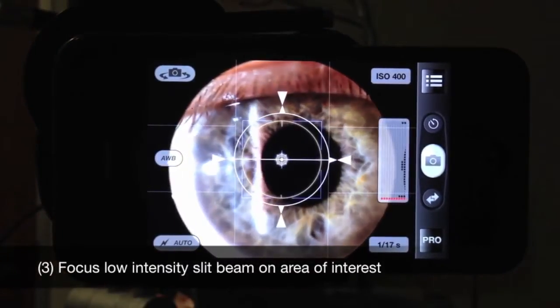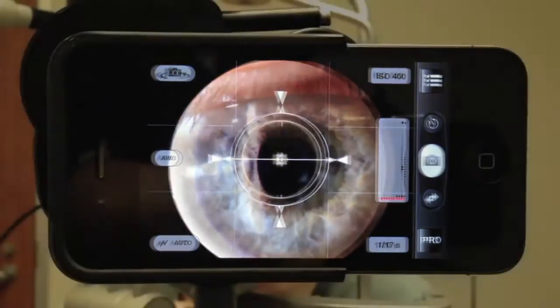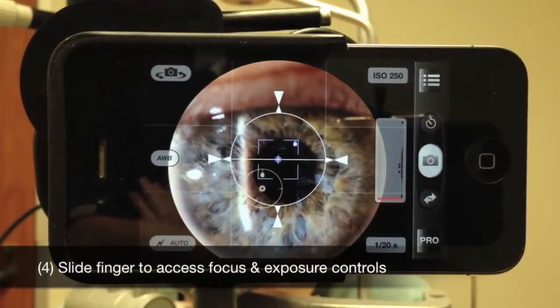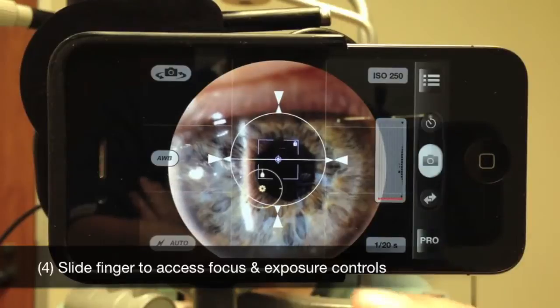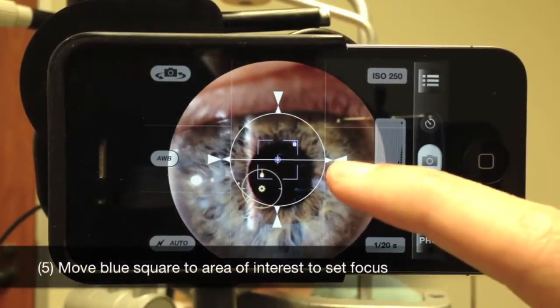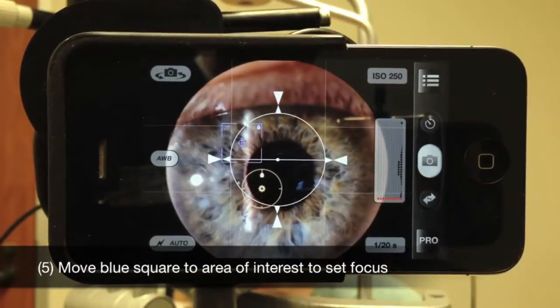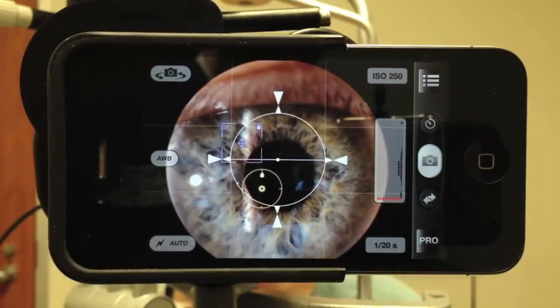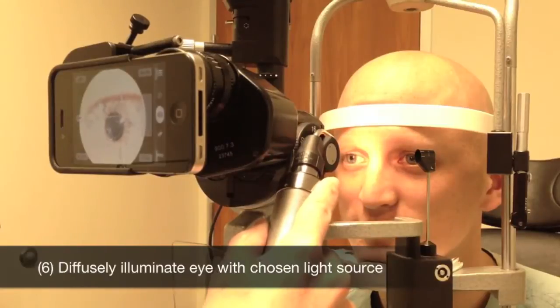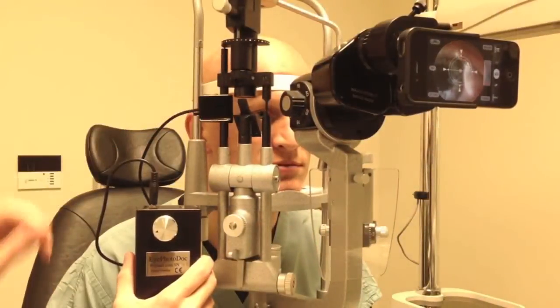Focus a thin slit beam on the lowest intensity setting over your area of interest. Slide your finger across the screen to access the blue focus square and the yellow exposure circle. Move the blue square over the area on which you'd like to focus. Next, diffusely illuminate the eye — a transilluminator works well, or you can use a clip-on light source.